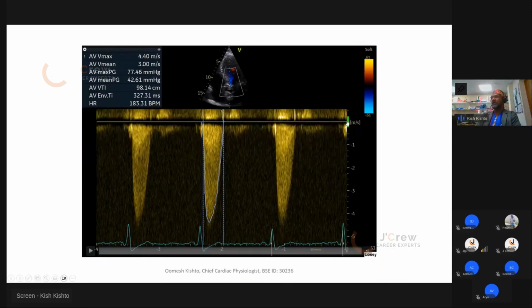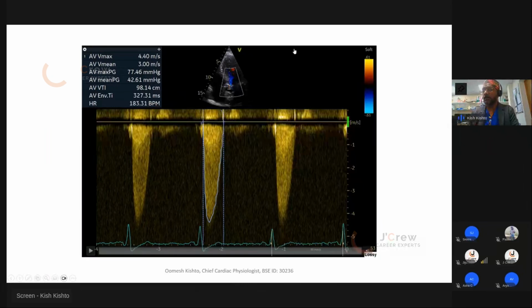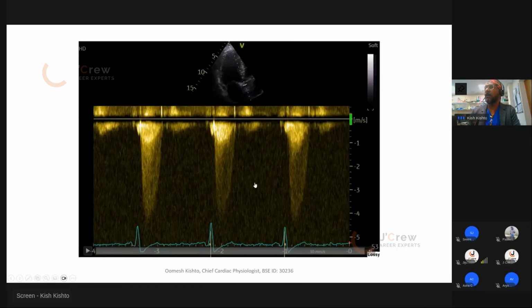So this is your CW across the aortic valve, and you see when you align it correctly, you manage to angulate it properly with the probe and then you have a good measurement. So this is your CW straight. I don't like measuring the fluffy bit, but the solid area, as you can see, is 4.4. That indicates severe AS. So I tried the three chamber view as well.